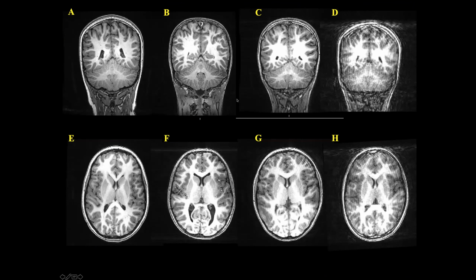Yes. Okay. So you have the crystal clear brain, where you can actually see the foliae of the cerebellum, both anterior and posterior. And you can see this image D, which has quite a bit of movement here. You can still see the putamen there fairly well. So there has to be quite a bit of movement of an image, but the foliae are quite blurred here.